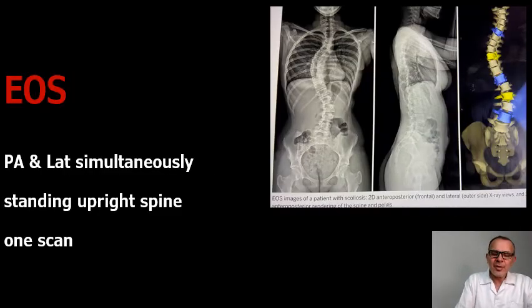Then we have, in my opinion, the best thing that's happening now in the diagnosis of scoliosis, which is the EOS.